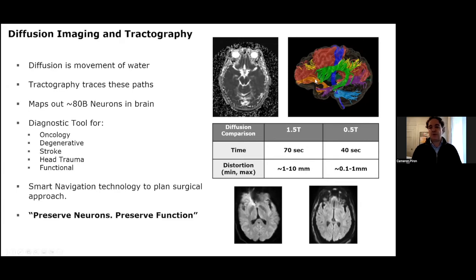So it becomes a tool not only for guidance in surgery, but also a diagnostic tool for things like head trauma and stroke. If you watch the NFL, you might see the saga of the quarterback in Miami who has a pretty devastating head injury. There's no doubt if you did this image, you would see severed connections within the brain that we're all hopeful will recover over time.